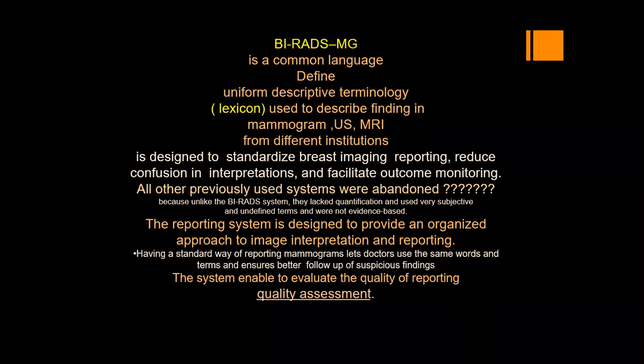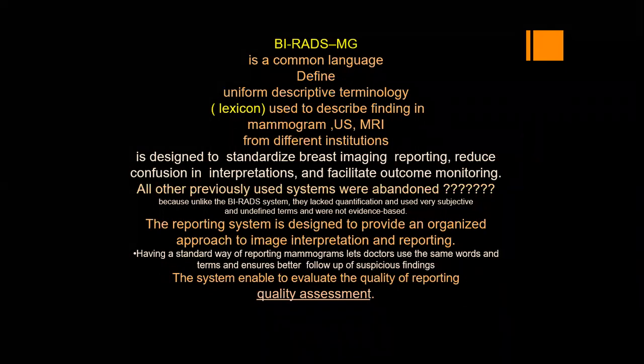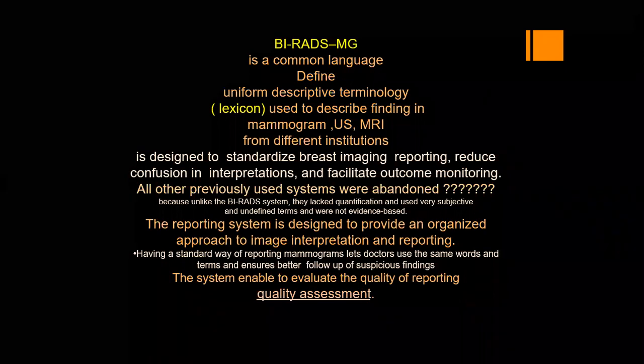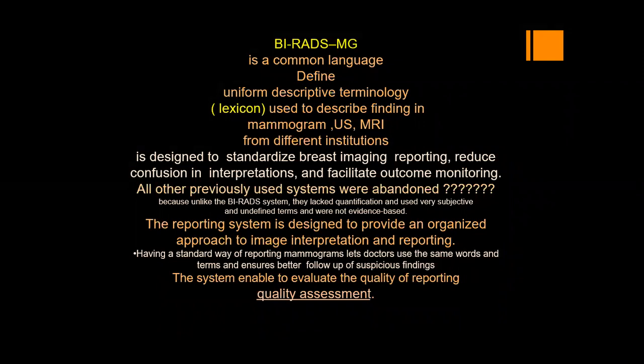From different institutions, it is designed to standardize breast imaging reporting. This will reduce confusion in interpretations and facilitate outcome monitoring. All other previously used systems were abandoned. Why? Because, unlike BI-RADS, they lacked quantification and were not evidence-based. The BI-RADS reporting system is designed to provide an organized approach to image interpretation and reporting. Having a standard way of reporting mammography lets doctors use the same words and terms, which ensures better follow-up of suspicious findings and also helps in quality assurance and reporting quality assessment.